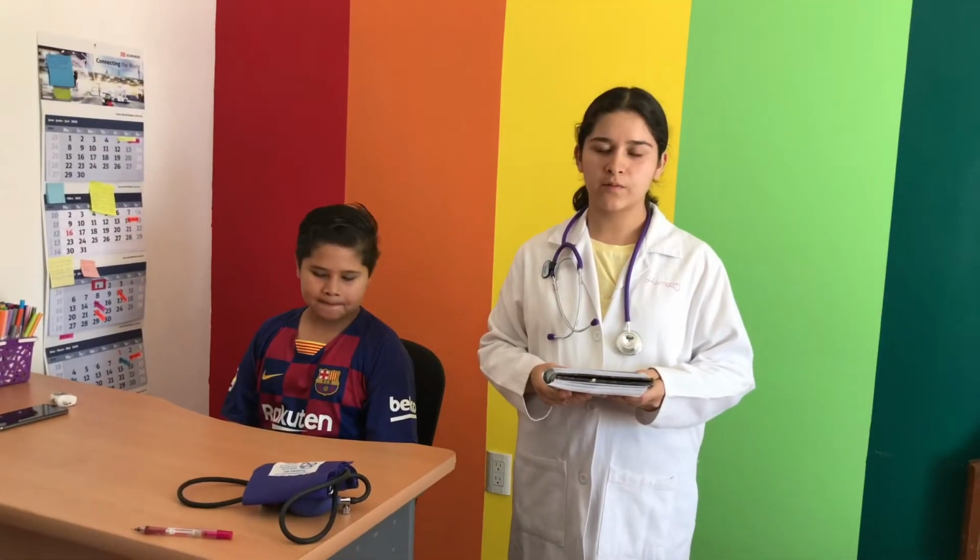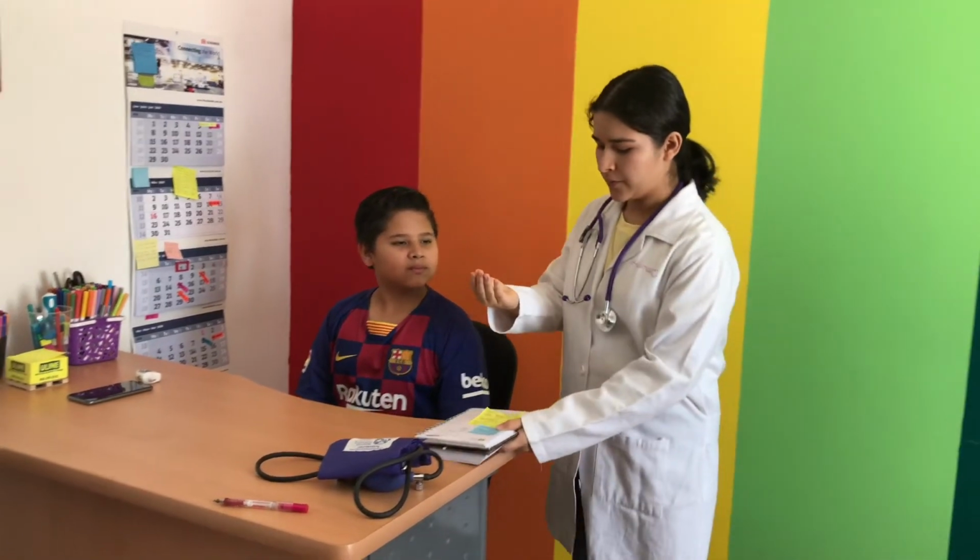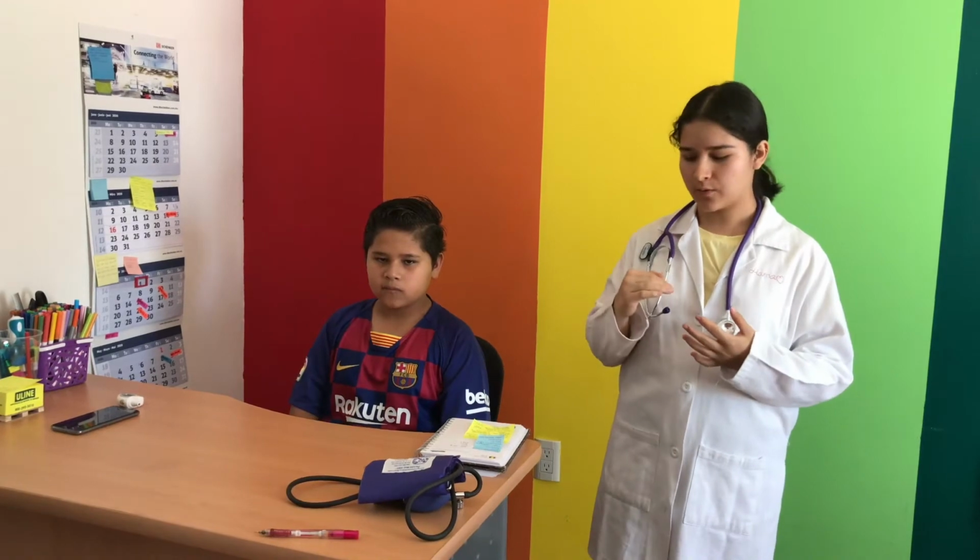So the fourth test we'll be running is the blood pressure. For the blood pressure, we're gonna use the brachial artery, which is this one. The first measurement we get is the systolic. That is when our heart contracts and pumps blood to all of our body. The second measurement we're going to get is the diastolic, when our heart expands and it's filling up with blood. So that's why one is high and the other one is low.